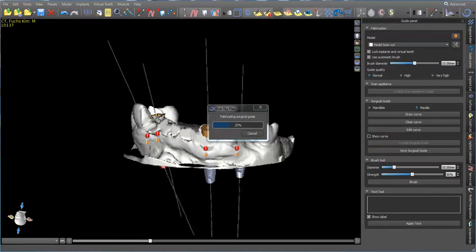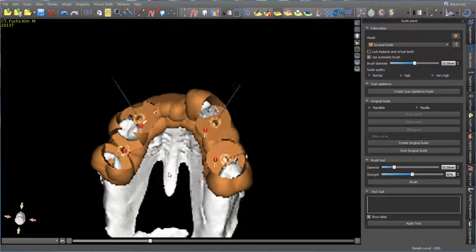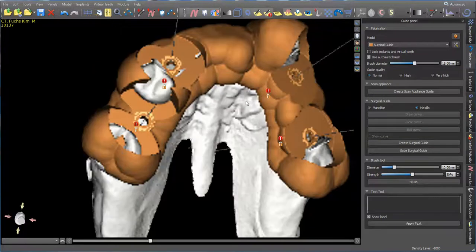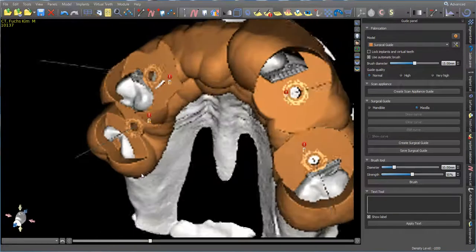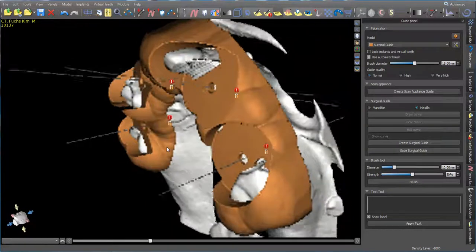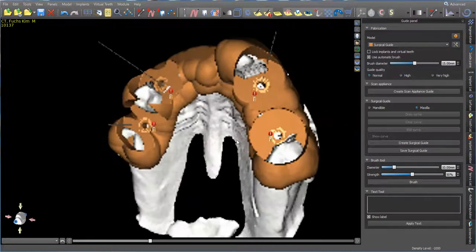Let the software think for a second. So there you have it. This is our little tooth-borne guide. And what I like about this is you're going to be able to see it seating on this tooth, this tooth, this tooth, and this tooth. You got 4 hard stops.